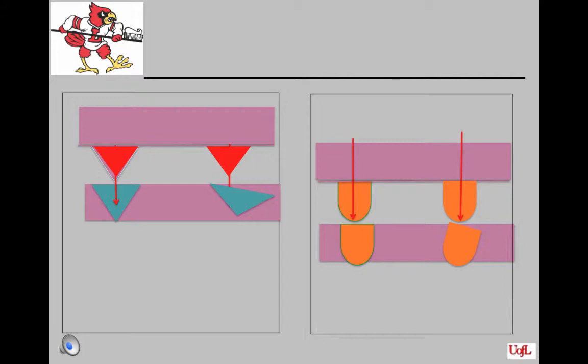Also, you have to remember that the articulator and the mandible close on an arc. If your ridges are very parallel, when you open and close, you're going to run into an interference. And when you check the occlusion record, the patient may hit a bump before totally closing into the record, which immediately makes him change his jaw position to avoid the interference. This is a natural response of the patient, but your jaw registration will be off.